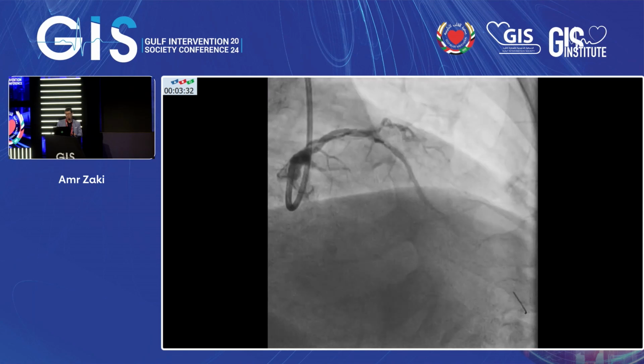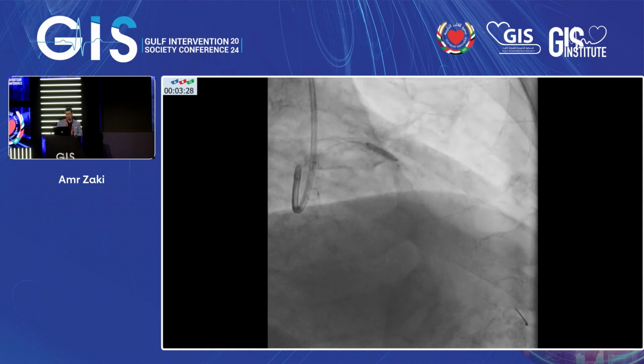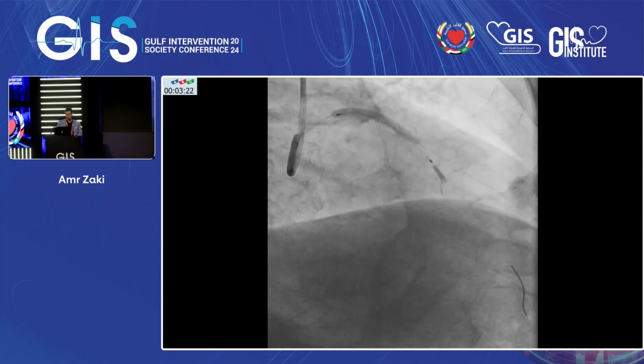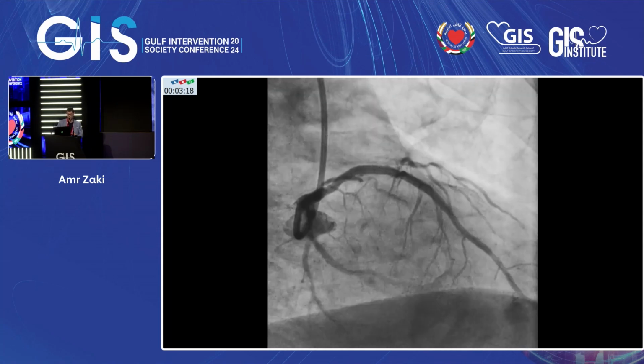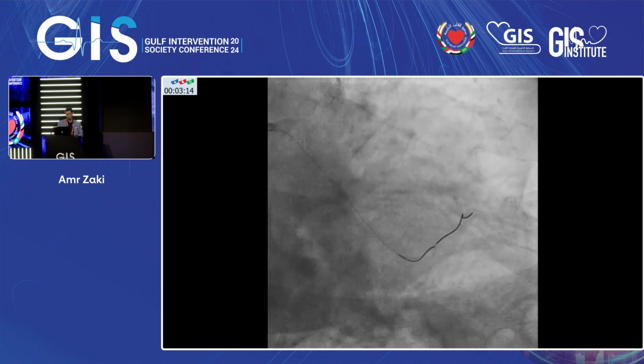After that, take the 1-to-1 balloon instead of IVUS, and it's okay. There is no dog bone, there is a well inflated balloon, and this is the stent, a long stent here with an excellent result, and then the post-dilatation. Make sure to have good post-dilatation.